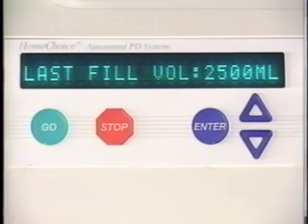The sixth parameter is last fill volume, which is the volume of the last fill to be delivered at the end of the therapy and left in the peritoneal cavity during the day. Press the down arrow again.